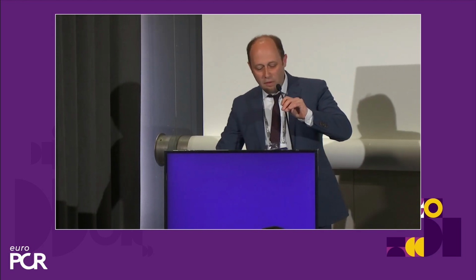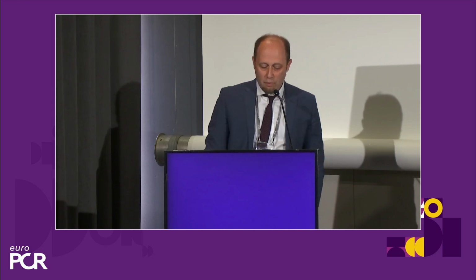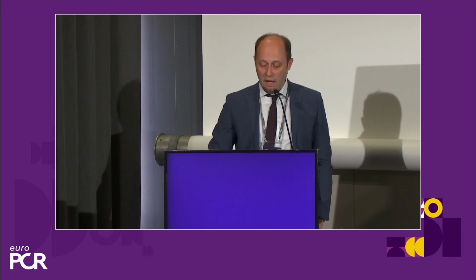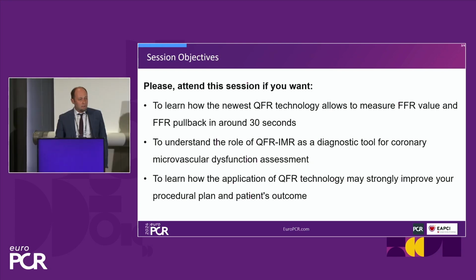Yeah. So just one short slide to show the aim of this session. In particular, to learn how the new generation of QFR technology allows us to measure FFR, not just as a single distal value, but also as an FFR pullback in around 30 seconds.